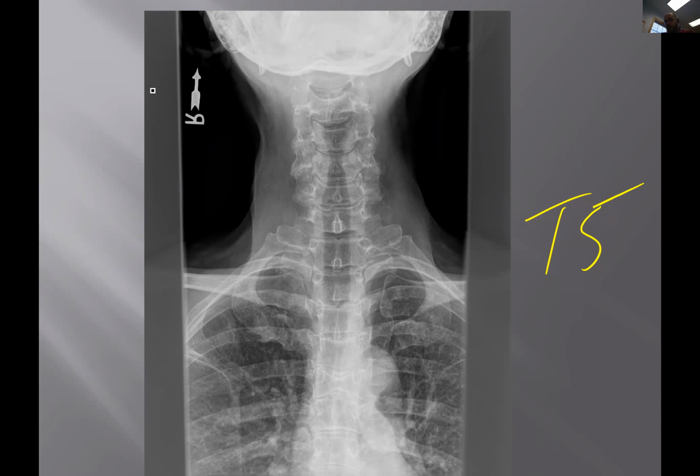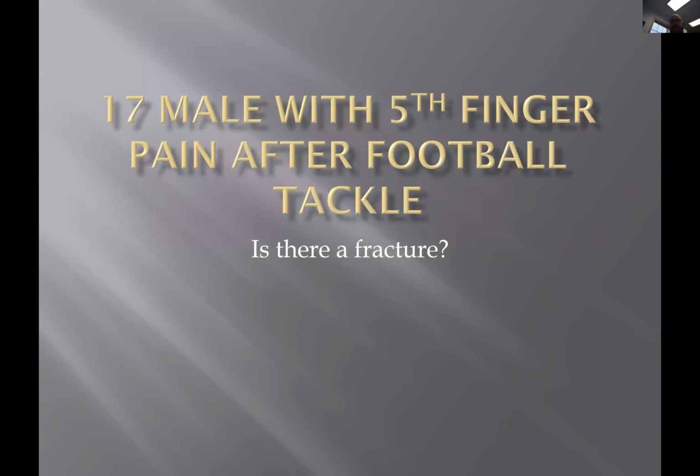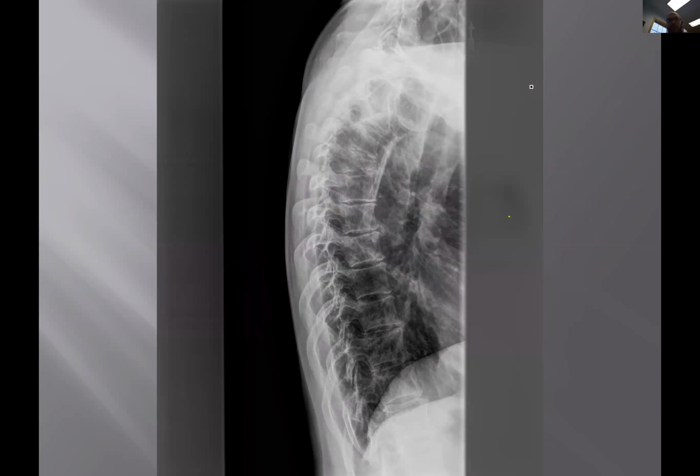And that helps you, of course, in how you treat and how you adjust, and if you adjust, and all kinds of stuff. So I thought it was a cool case. Any other questions? Does that area potentially come with increased problems or symptoms over a person's lifetime, or is it unrelated? Good question. Basically, that area will be just as stable. The bone will be just as strong. You can probably adjust right on that segment.